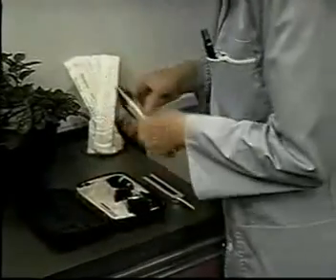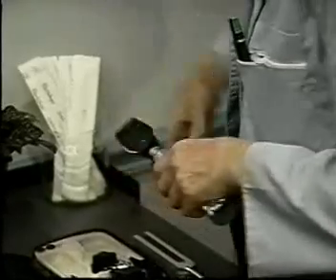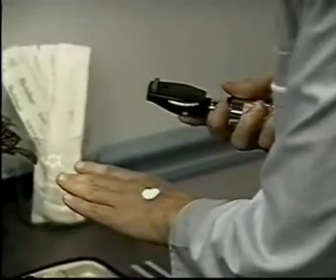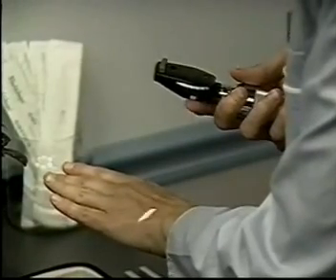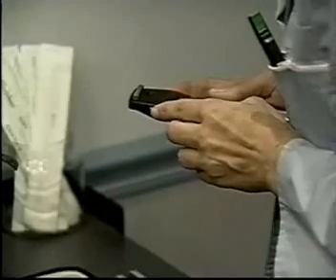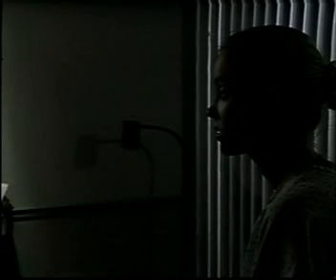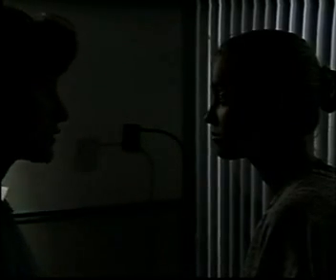When you're ready to examine the fundus, switch on the ophthalmoscope light and adjust it to the large round beam of white light. Also make sure the light is bright enough. Set the ophthalmoscope to 0 diopters. After darkening the room, ask the patient to look over your left shoulder at a specific spot on the wall. I want you to look over my left shoulder.